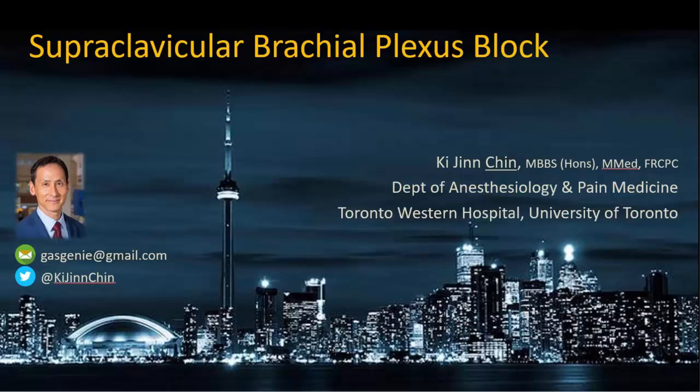This video will illustrate a single-injection supraclavicular brachial plexus block using a corner pocket technique.